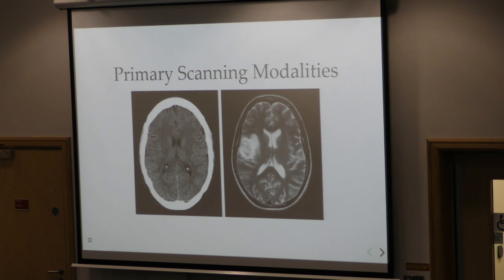Now, if you just wanted to see what that 3D shape looked like, you could take all the collected pixels from those 2D layers and create a kind of three-dimensional array of that and render it using a volume rendering technique, like a point cloud, and be able to see an approximate distribution of that in 3D and see what that looks like.